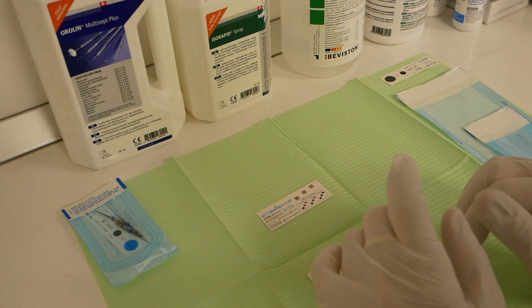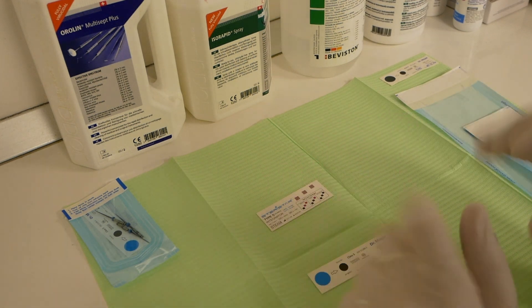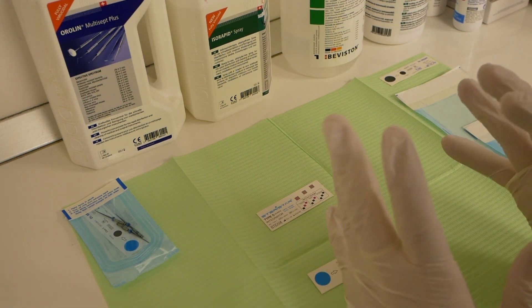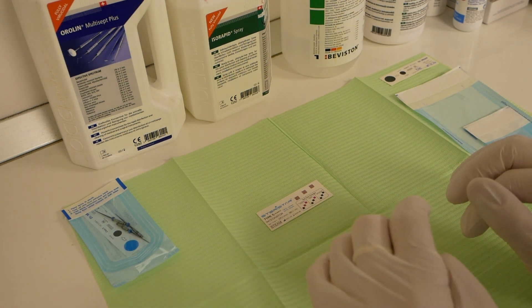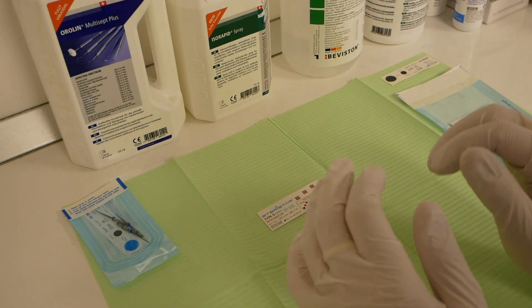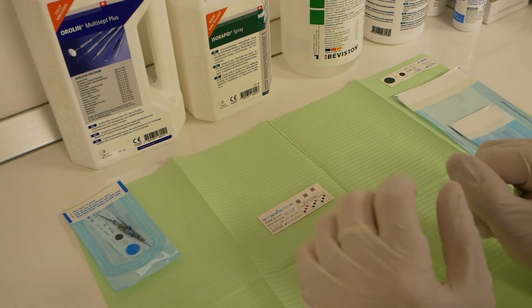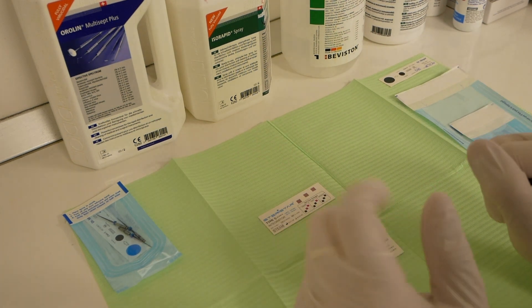Hello, today we'll talk about dental sterilization, and particularly how you can ensure that you have obtained proper instrument sterilization in autoclave pouches. There are several ways you can check your autoclave is working properly and your instruments are getting sterilized.